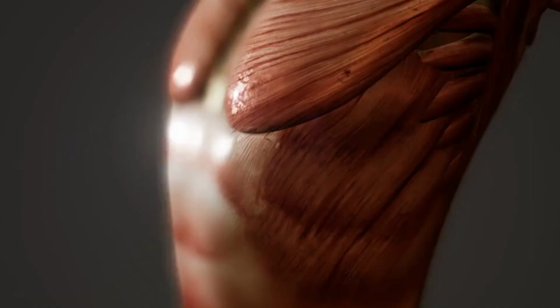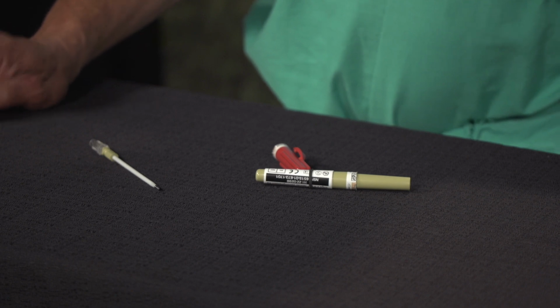And the pitfall on that procedure is to make sure that you go on top of the rib. Spread the muscle big enough so it stays open. Put your finger in, feel the diaphragm, the lung, the heart, and the chest wall. And then finally put a 3-sided dressing so that you don't totally occlude it once again after you have successfully resuscitated the patient.